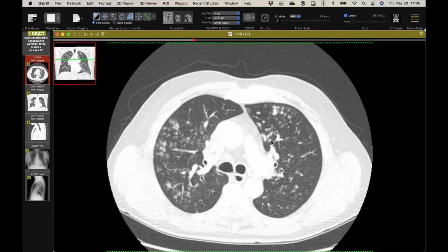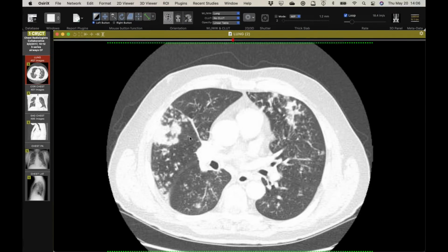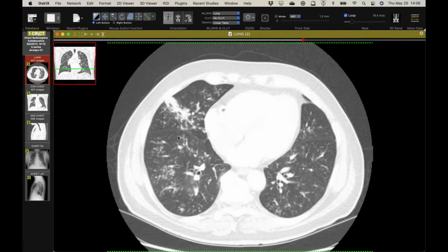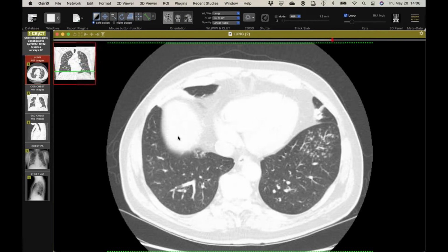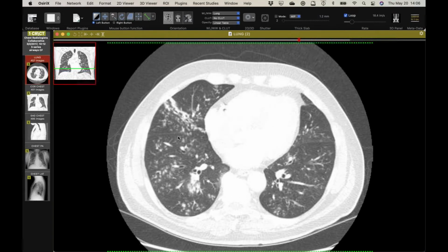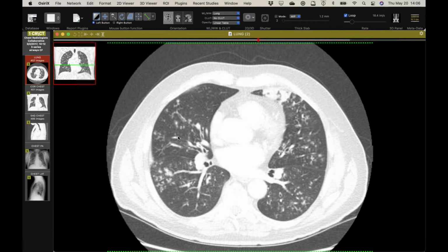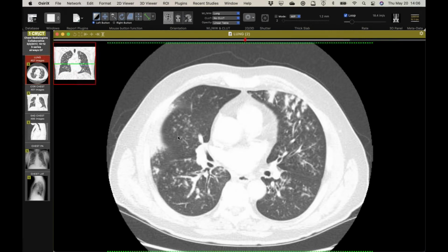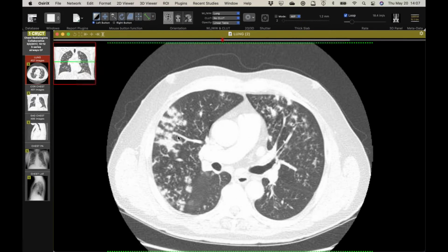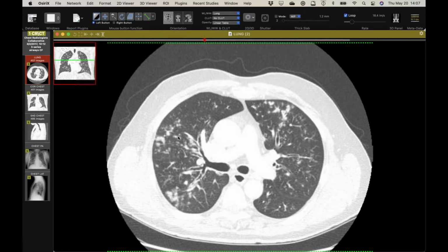Yeah, so bronchiolitis. We've got a little bit of bronchial wall thickening, but not a lot, and then some consolidation around it. So it looks really good for an acute infection, although there's quite a bit of disease. You might wonder about something more chronic, like nontuberculous mycobacterial infection. Not the most typical demographic, but does occur. Tree and bud, interestingly, is not that common with endemic fungal infection in my experience. I've seen it with aspergillosis, but we don't see it with histo or blasto, or I'm not seeing it with cocci.